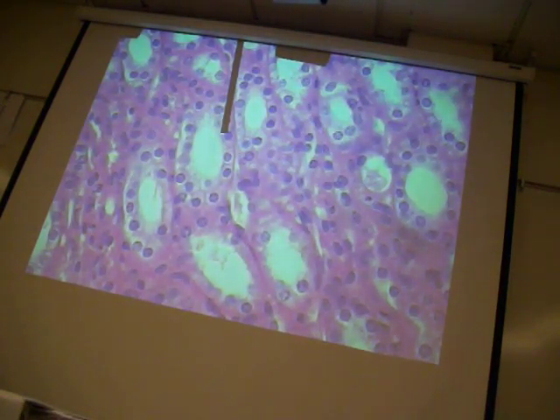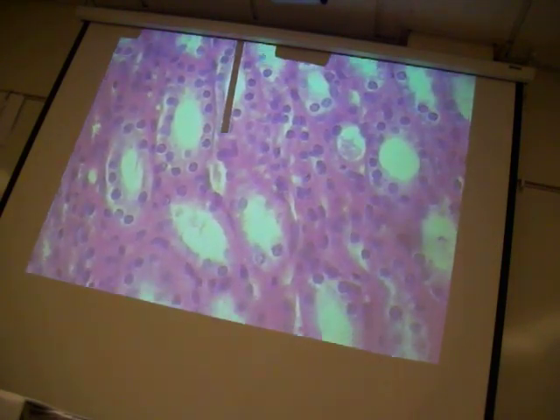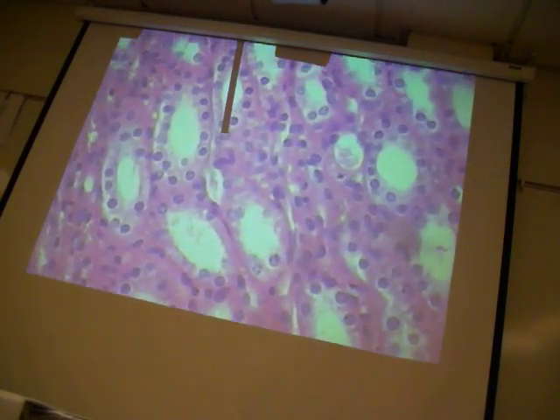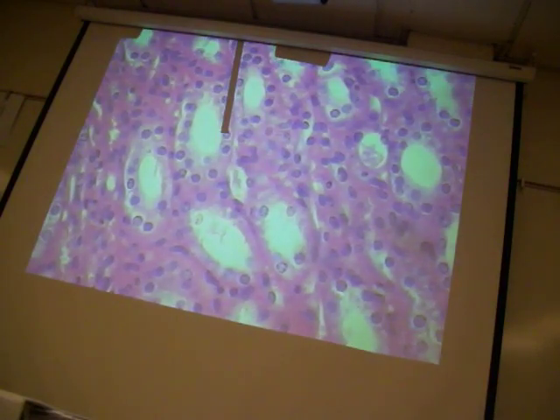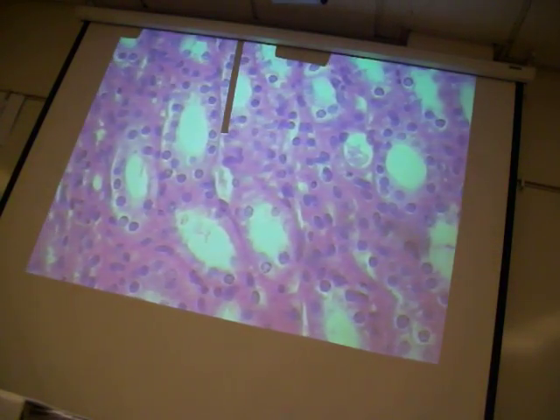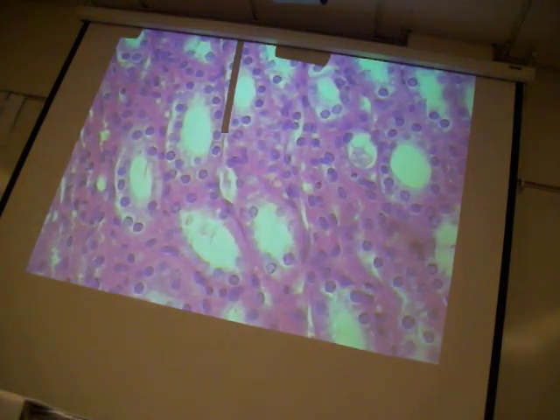So the kidney tubules are a good place, right? Because they're involved in secretions, certain glands are going to have cuboidal cells. So here's your cuboidal cells that you're looking at, and then the basement membrane. See this dark area right here where the pointer's pointing to? That's the basement membrane right there. So this is the free surface over here. Here's the basement membrane right here for this cell that the pointer's pointing to.